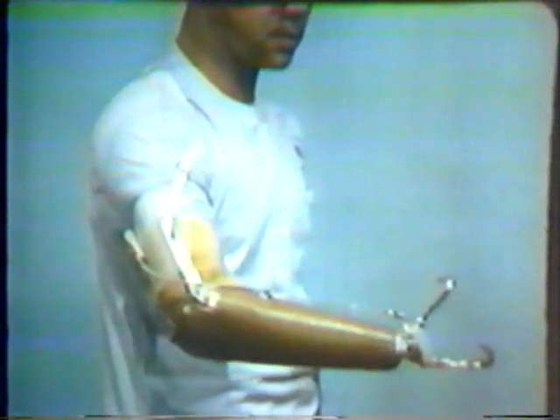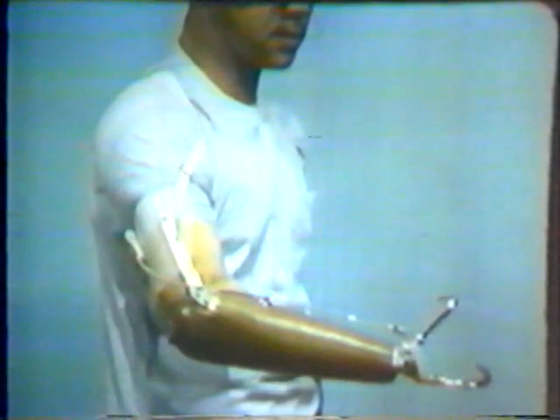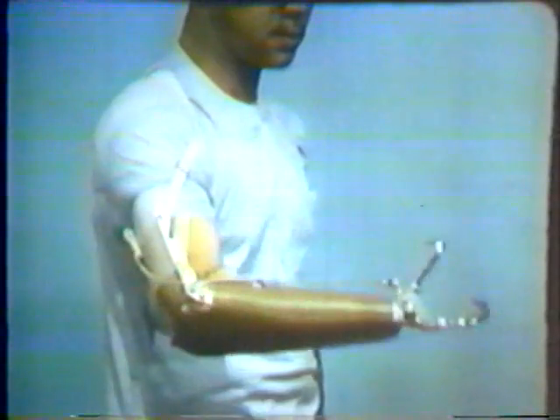Without the housing, tension on the cable would tend to cause the elbow to flex. This illustration demonstrates the path along which the control cable would pass in the absence of the housing. The housing, then, serves to maintain a fixed length between the two ends of the control cable, regardless of whether or not the elbow is flexed. Because of the housing, the amputee can maintain the terminal device in the open position throughout the range of elbow flexion, with the elbow fully flexed or completely extended.